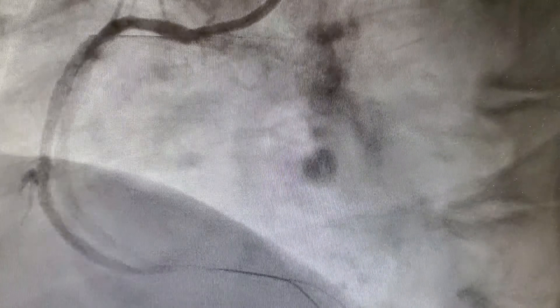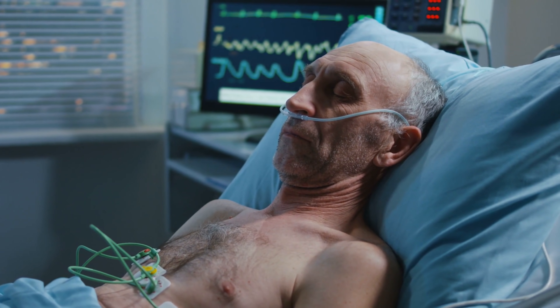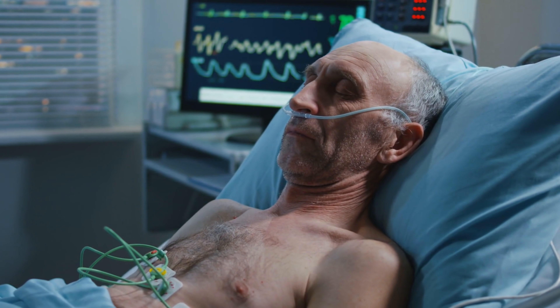A check shot with contrast shows that the blockage is no longer there, as you can see in this angiogram. The catheters and wires are then removed from the heart, and the short tube in the femoral artery or the radial artery is then removed. The bleeding from the access site is controlled by manual compression, and the patient is then taken to the coronary care unit for observation.